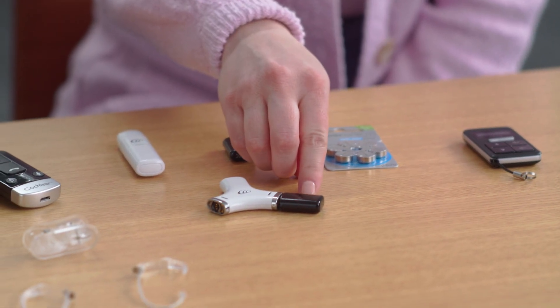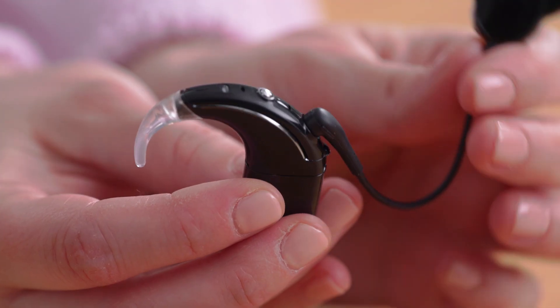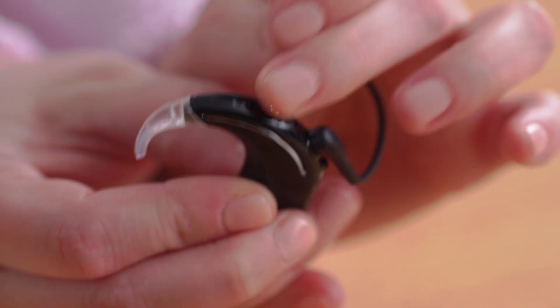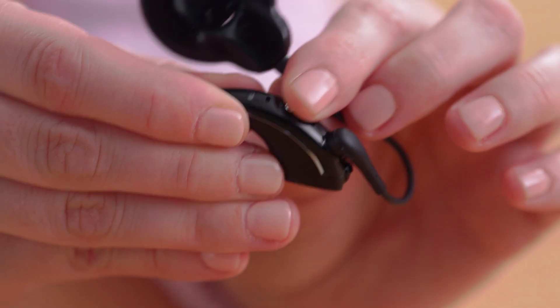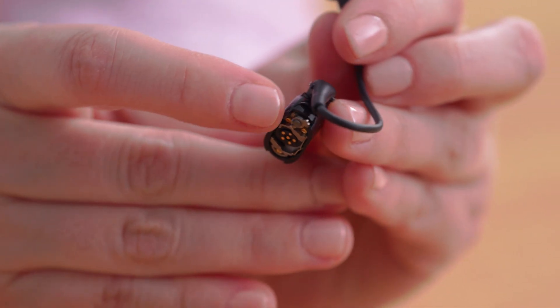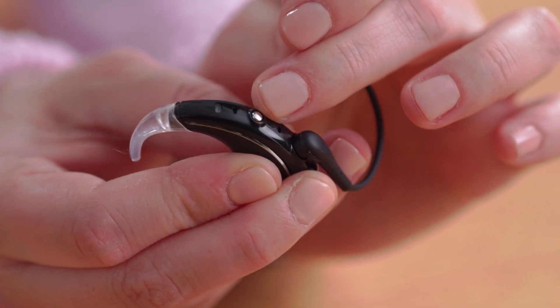Your kit comes with disposable batteries as well as rechargeable batteries. For now, we'll use a rechargeable battery. To turn the Nucleus 8 on, simply attach the battery or press the button one time. To turn it off, you can also remove the battery or hold the button until the light turns a steady orange. There is also a tamper-resistant battery lock, mostly used for pediatric recipients. The processor has two microphone ports as well as an indicator light.